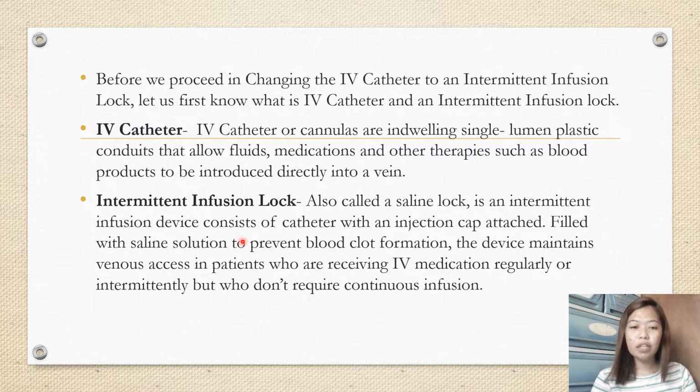an intermittent infusion device consisting of a catheter with an injection cap attached, filled with saline solution to prevent blood clot formation. The device maintains venous access in patients who are receiving IV medications regularly or intermittently but who don't require continuous infusion.